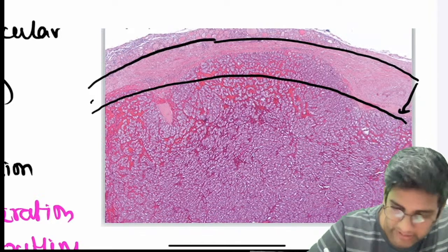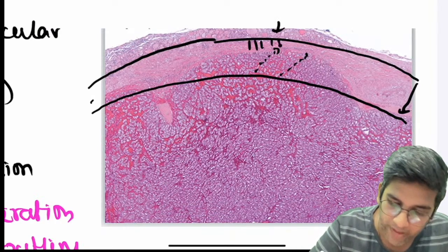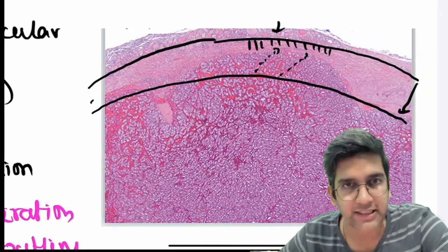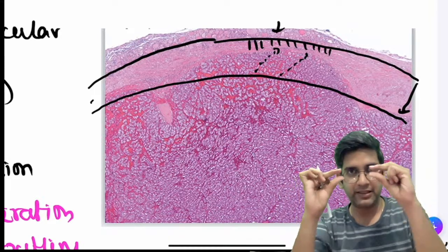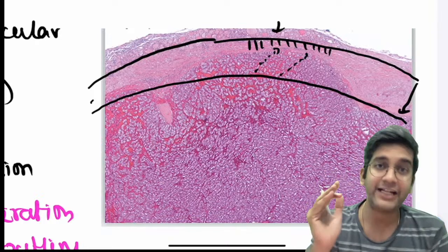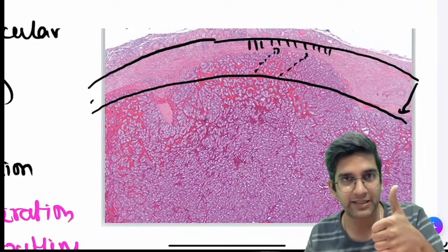But if you look at this, the outline is not altered, but this guy has gone here. It has made the capsule very thin here. Do you accept that? If yes, comment yes. Yes, definitely. In the sides, I have this much thickness, but in the center it's become smaller because the tumor is pushing. It has not caused a desmoplastic reaction. If it had, I'd have altered the outline of the capsule. So it's questionable. It's no desmoplastic reaction.